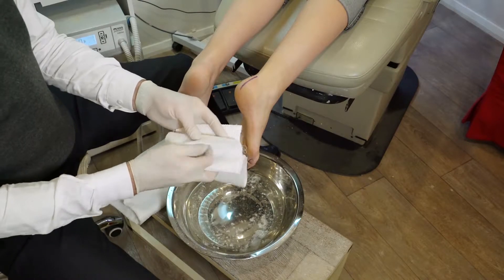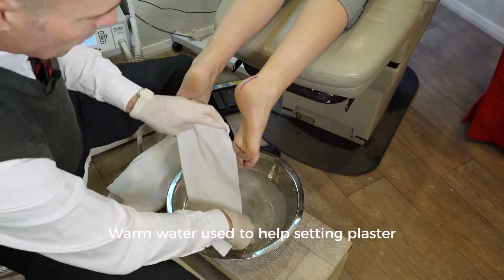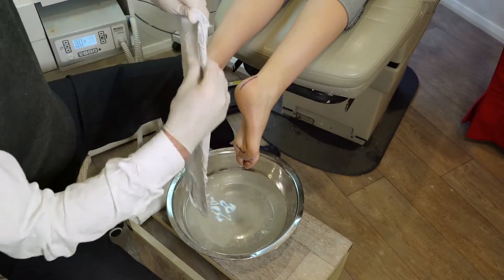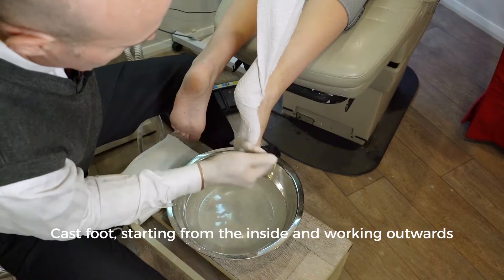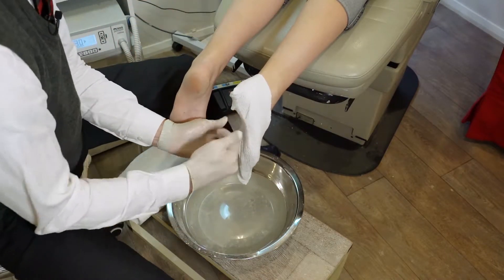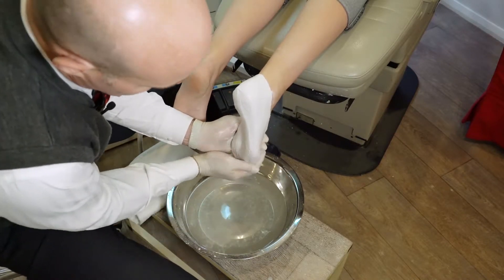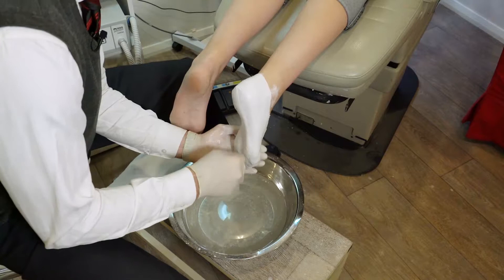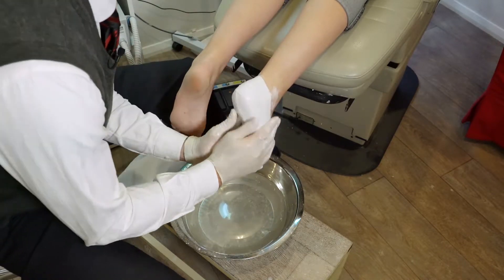I've made up a plaster wrap to wrap around the foot. We use quite warm water — the reason for that is it allows the plaster to set quickly and is also more comfortable for the patient. An important part here is to make sure that we smooth it out really nicely. The smoothing helps the plaster to stick together, stick to the foot, and also creates a nice strong cast at the end.